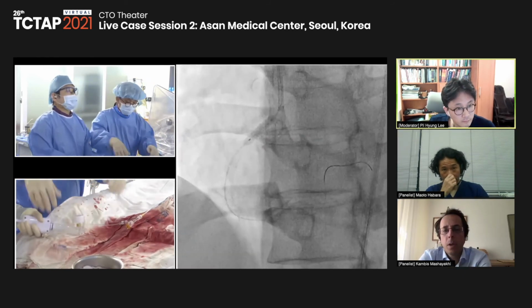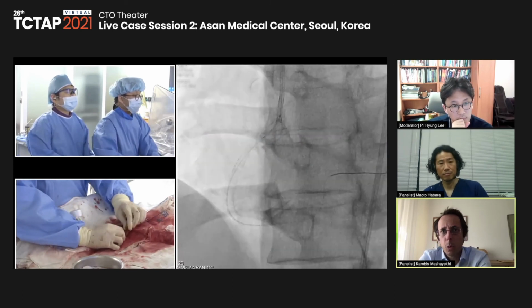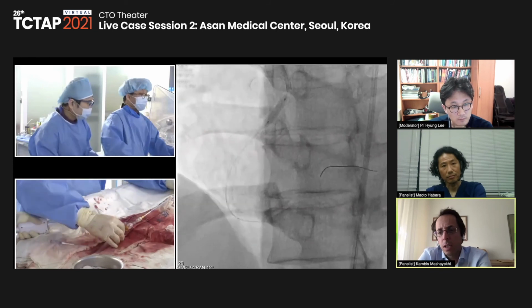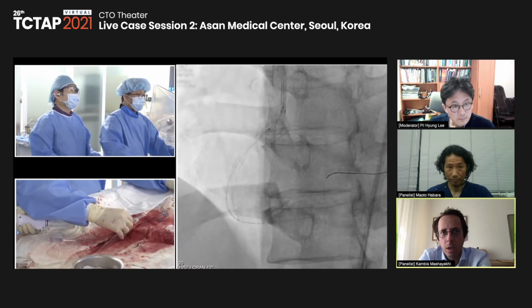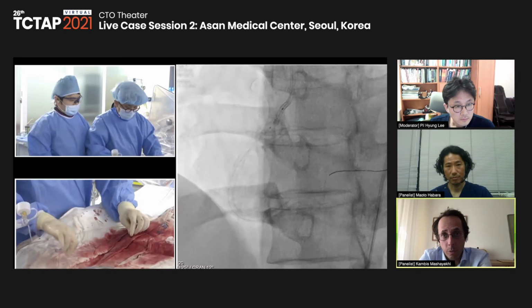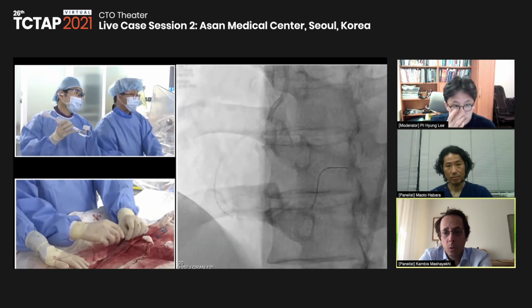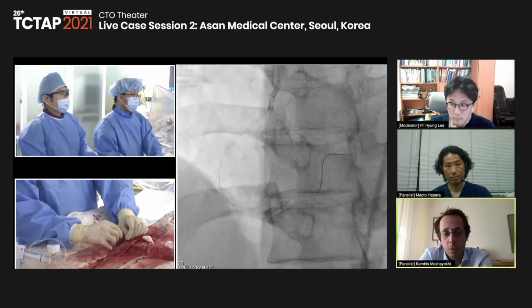In Germany, actually, we don't do routine follow-up. In multivessel disease, if we have another stenosis to treat, then we schedule it 3 to 6 months later. That way we also see the result, or any problem if it's going on the CTO side. What I really follow up is when I have excessive calcium and also subintimal tracking where I couldn't go through, and I couldn't do perfect stent optimization due to the risk of subintimal rupture.